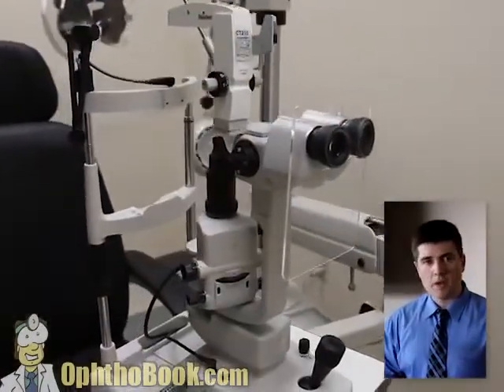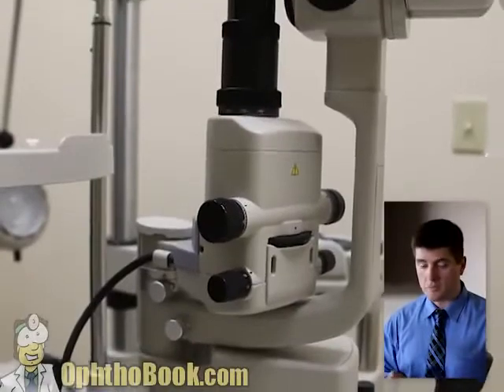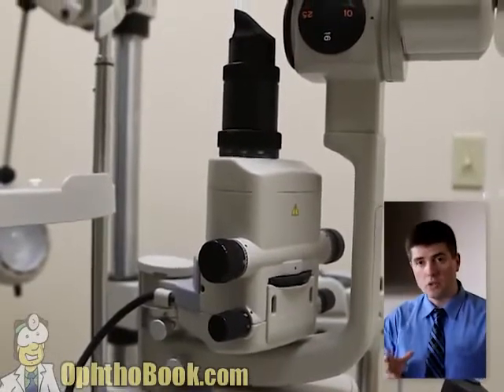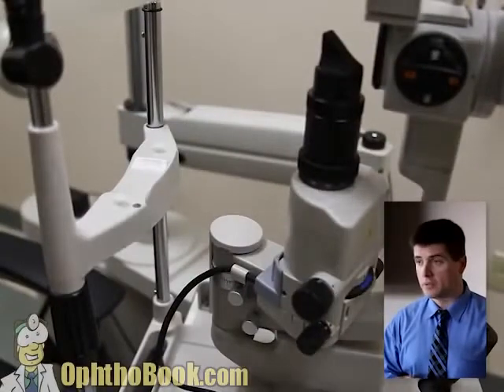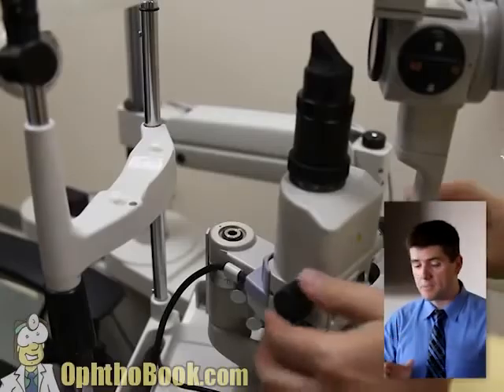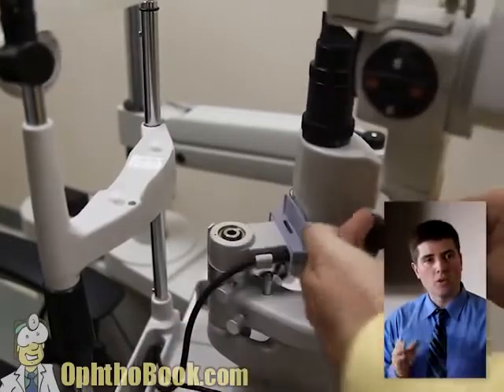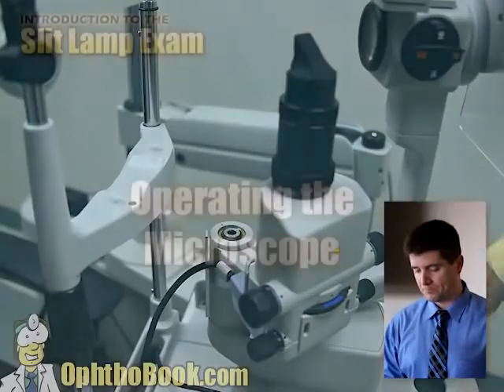This is the modern microscope that we use in all of our clinics. This is a version by Topcon, but many of the other manufacturers are making this style. The light is down below, which is nice, but all the controls are in one central location for controlling our light and our filters and our various settings. But no matter what microscope you use, they all have the same basic principle, in that there's a common rotational pivot point that they all work around in order to focus on the eye.